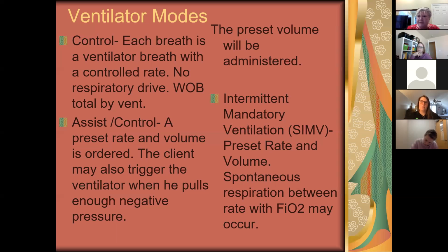Well, no, they'll be dead by the time they get back from pulmonary function studies. So they simply say, okay, how much does this person weigh? Or what do we think they weigh? Or if you're in today's society, how much do the beds say they weigh? And then we can sit there and say, okay, 10 to 15 mLs per kilogram, we should give them this type of tidal volume. So those are the 3 things. There's other things we can dial in, but those are the 3 things that the mode involves.